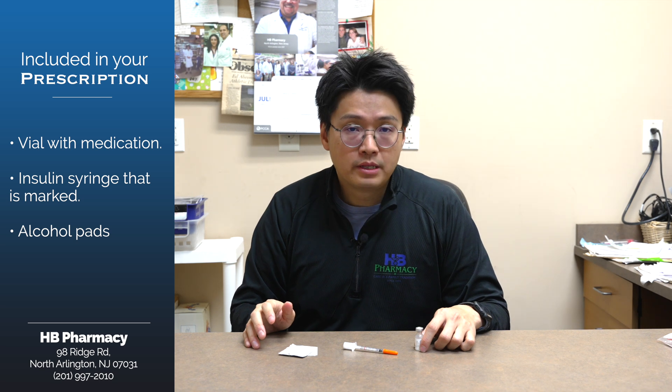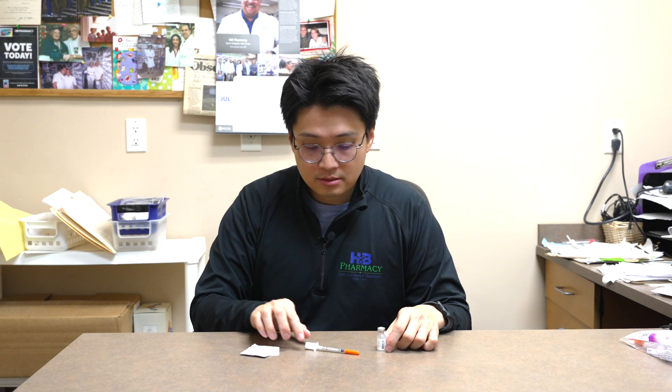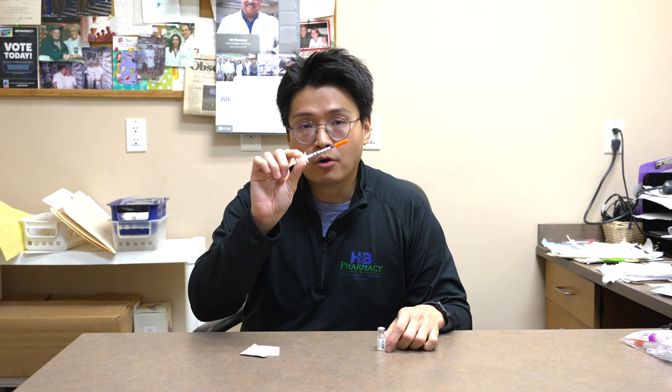On our label, it will also contain the strength of the medication, the volume in milliliters, and the units. We will also mark them for you.